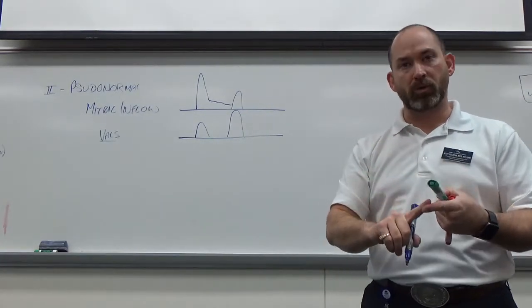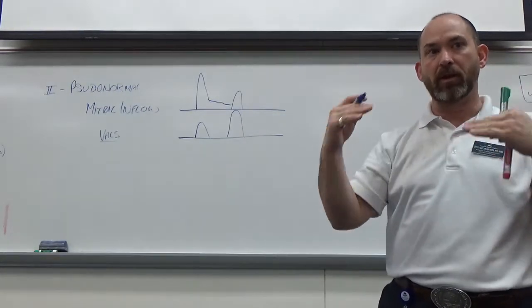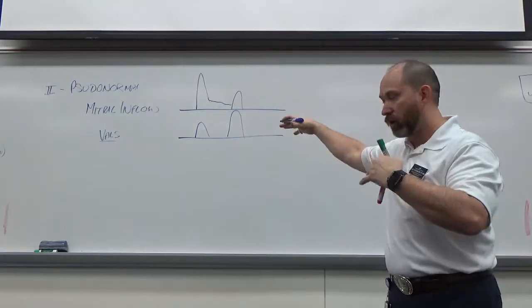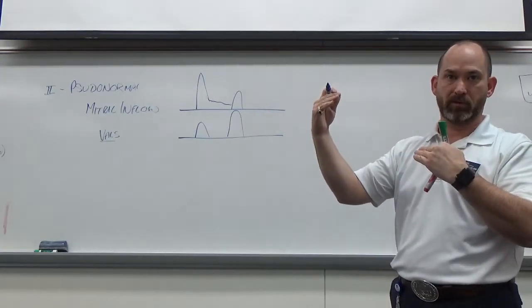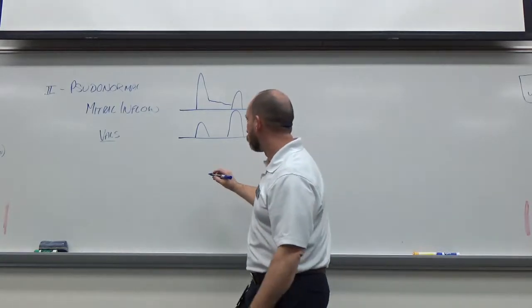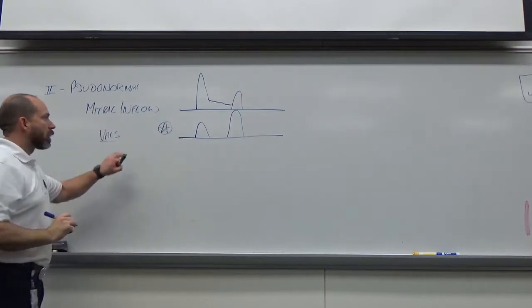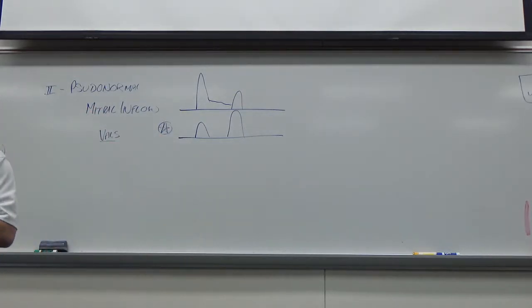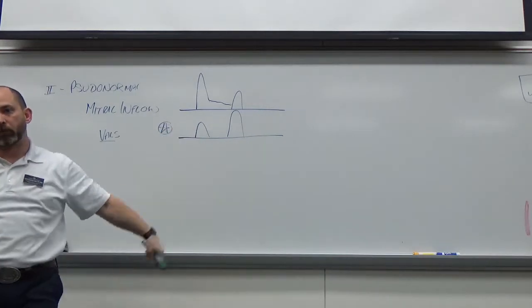On impaired relaxation, the E is already smaller than the A, and they just depress. In this case, it will depress it, but this actually forces my E wave to become smaller than my A wave. This is really your first clue that this is a pseudo-normalization. So I got a normal waveform, and it changed with Valsalva.